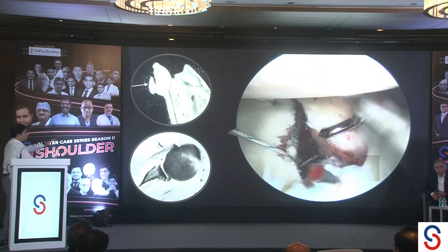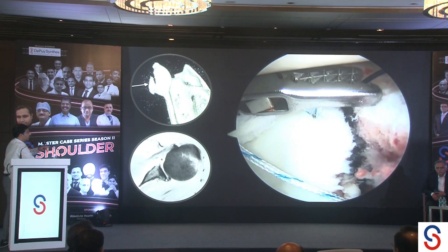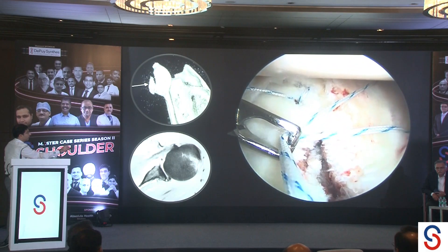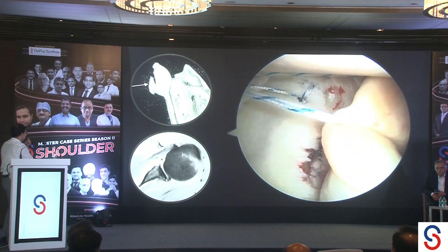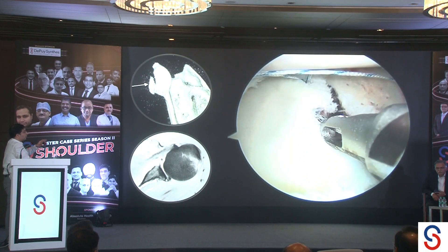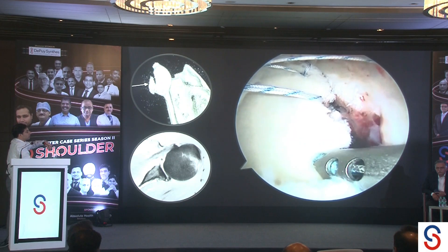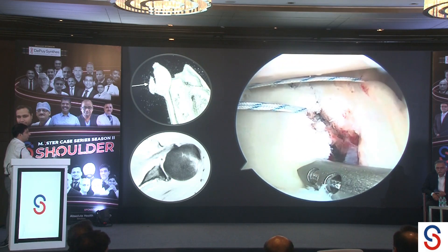Both sutures are brought out, and I use my spectrum to go around the fragment and railroad the suture across. The medial row anchor now has two sutures crossing the fragment. I need to get them onto an anchor at the ridge of the bony Bankart, and I can do a trial reduction to find the best position. I prefer using a standard anchor and tying the sutures down rather than a push-through anchor, because it allows fine-tuning of the reduction. Finally, one anchor is placed superiorly, again going through the labrum.